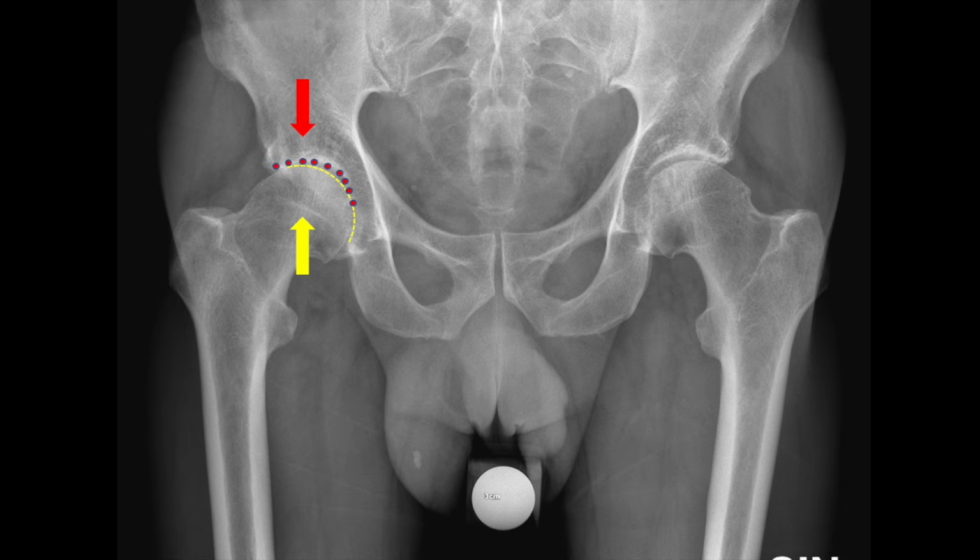In this other X-ray, you can see how the two articular surfaces are now in close contact with each other, as the space that would normally separate them is no longer present. The goal of the surgery is to relieve pain and allow proper mobility of the lower limb, using artificial components that recreate the lost space. We've talked about the indications for hip replacement, but now I'll finally tell you how the prosthesis is made.